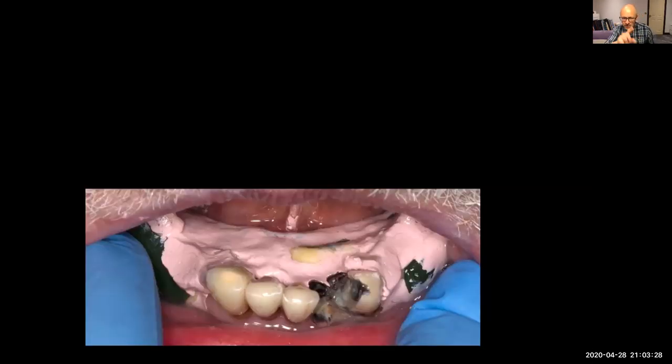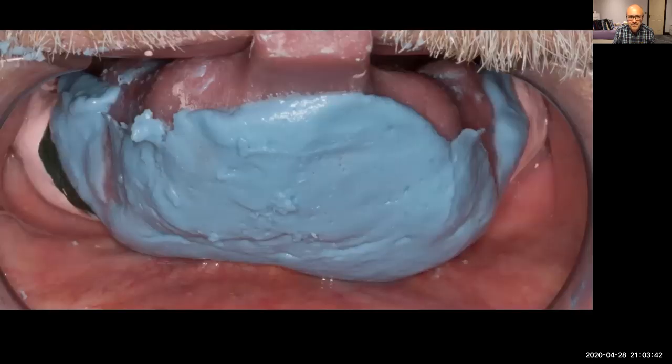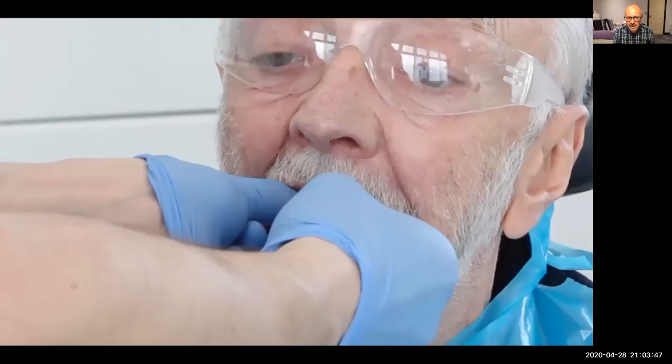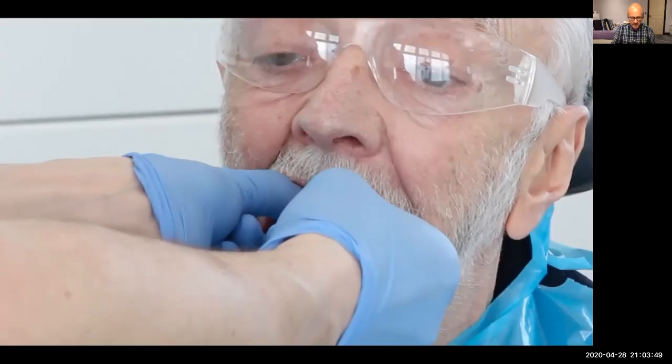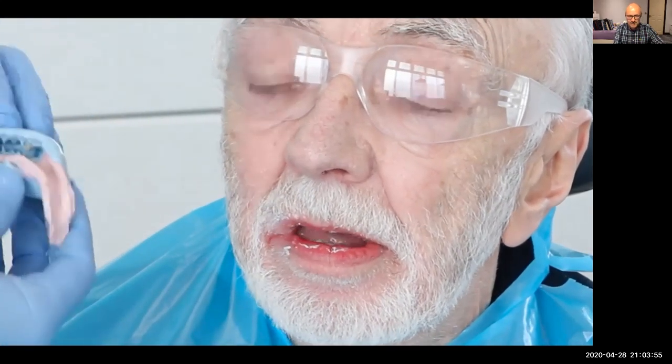It's good. So we get this impression there like this. And then over the top of that, I take this over tray there, sit it over the top of those teeth like this. It goes into the mouth there, and then we take it all out together. It all comes out together just like that. And it's dead neat. It's great. Locks in together beautifully.